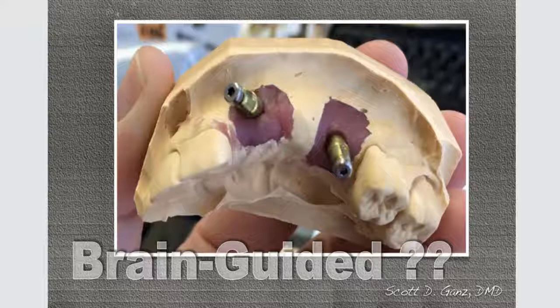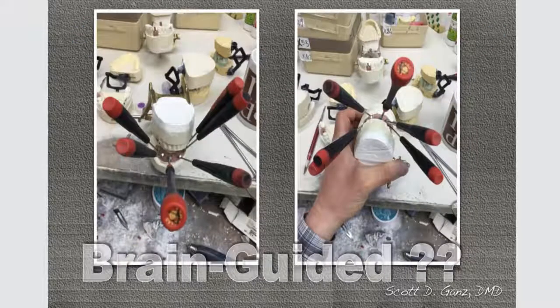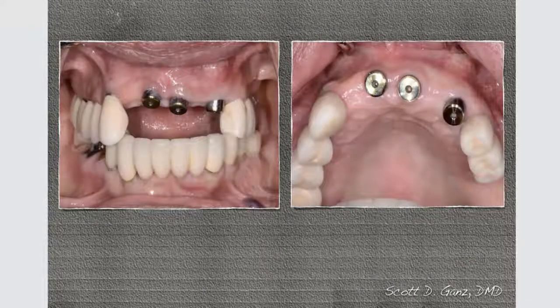And so the concept of prosthetic gymnastics is that when the laboratory gets a case like that, where the implant is located in a bad position, and you want to be able to then restore it, somehow the laboratory has to create the link between that implant and the restoration, and that is prosthetic gymnastics. And so when we evaluate for these types of cases, when we're dealing with multiple implants, as you can see here with screw access holes coming out all over the place, we have to be able to plan properly.